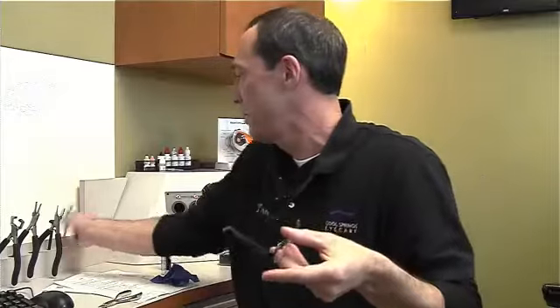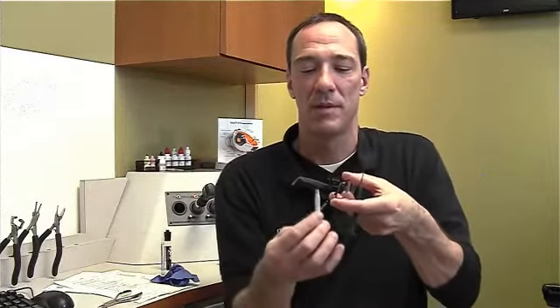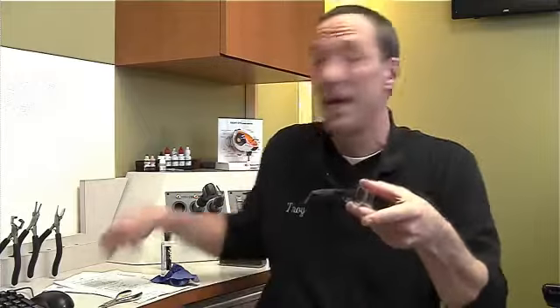And we're going to use what we call an optometric screwdriver. Now, there's regular flat tip ones, and then there's regular cross tip ones, or as we otherwise call it, a Phillips head. And in my case, I have a flat tip screw.